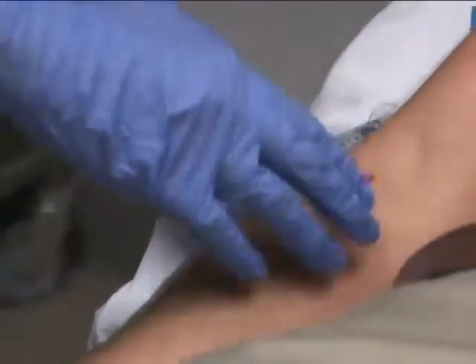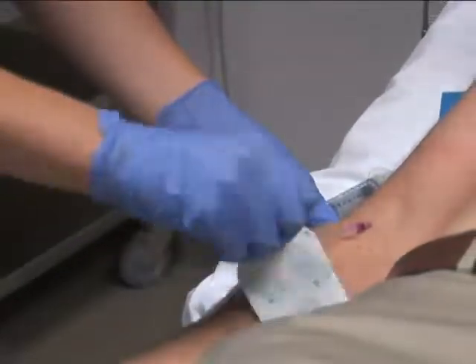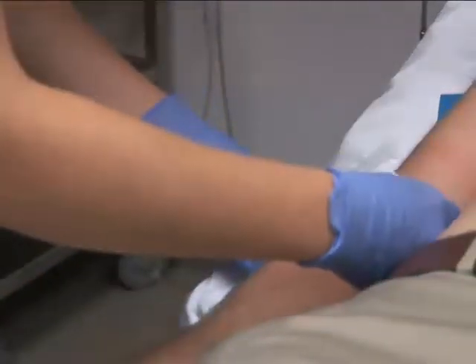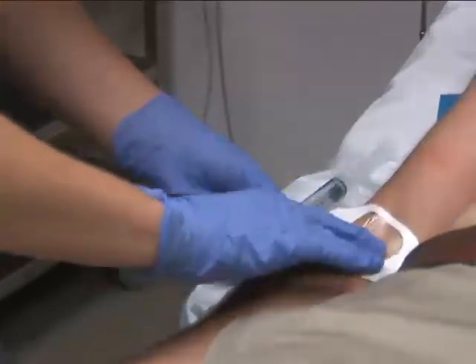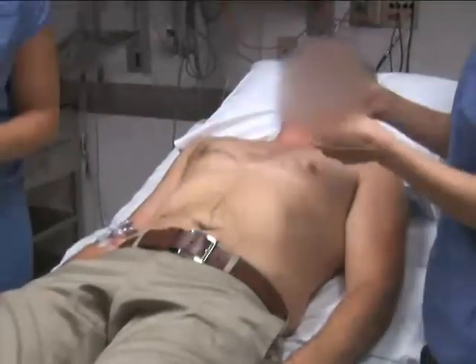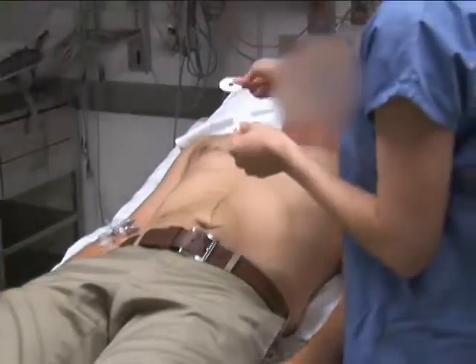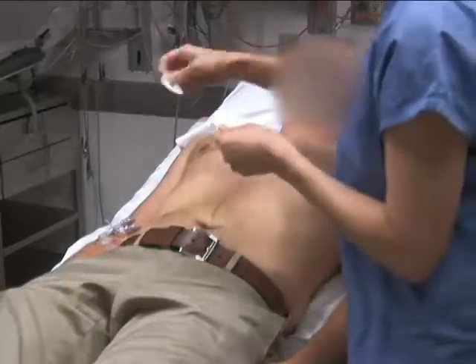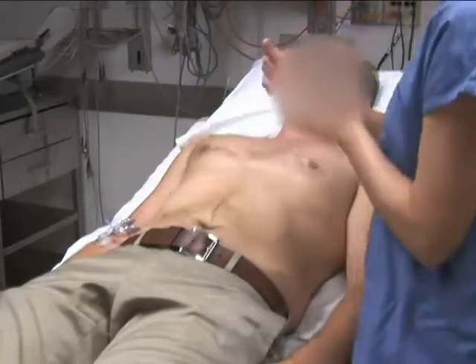A 20 to 22 gauge intravenous line is placed, typically in the right arm, and a short extension tubing filled with saline is attached and the line is secured with tape. The ECG monitoring electrodes are applied by the sonographer, and the patient is placed in the left lateral decubitus position for echocardiographic imaging.